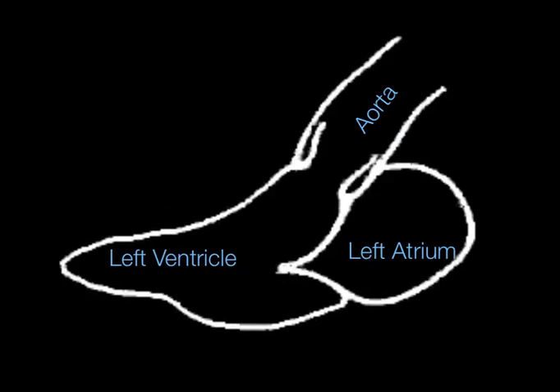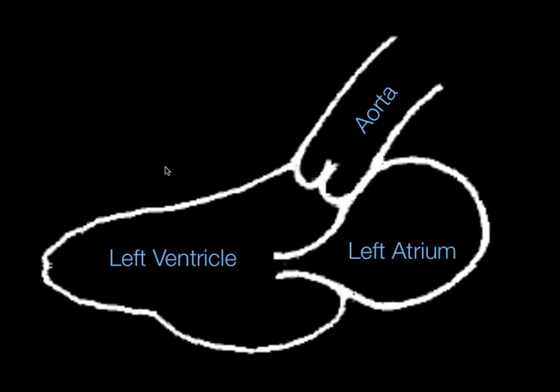And this is not an ultrasound. This is just a schematic diagram demonstrating systole and diastole. So when the heart squeezes, that's systole, it squeezes its contents out of the aorta, and out through the aorta, I should say. And during diastole is when it fills. And you can see that during diastole, the valves open and the heart fills with blood. And this is the septum seen here. And the right ventricle, not pictured, would be right up here, in the parasternal long axis.